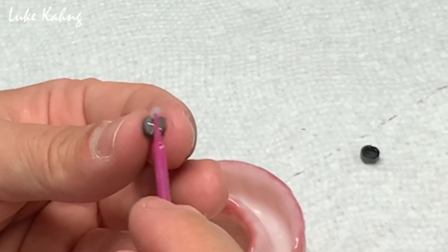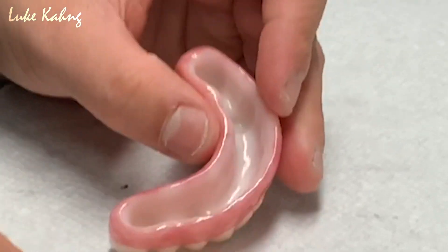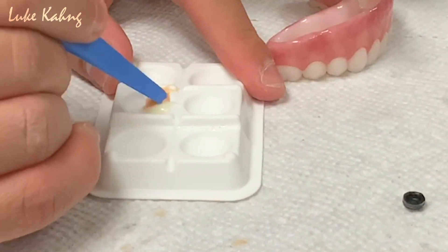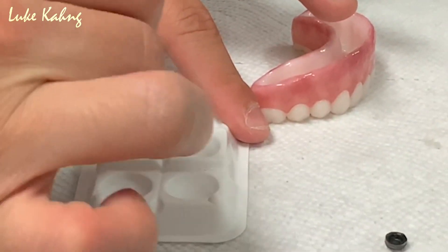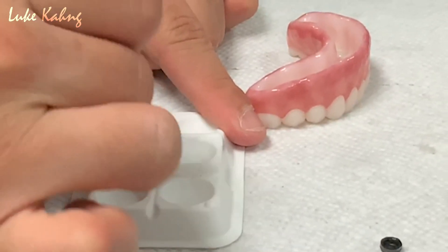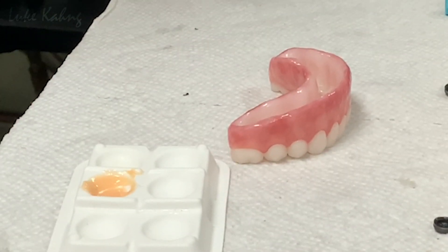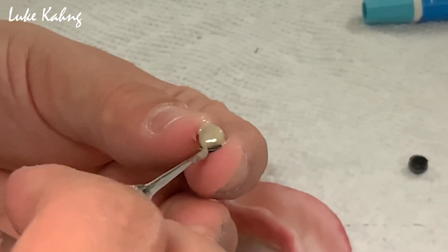Apply the A and B paste and mix the two together. After this, apply the paste to the attachments, and then place them into the holes in the locator.